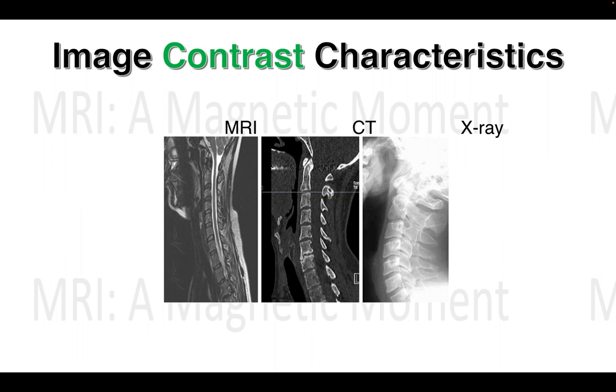So, having said that, one of the main advantages of MRI compared with other imaging modalities is the excellent soft tissue discrimination of the images. The contrast characteristics of each image depend on many variables, and it is important that the mechanisms that affect image contrast in MRI are understood at least at a basic level.